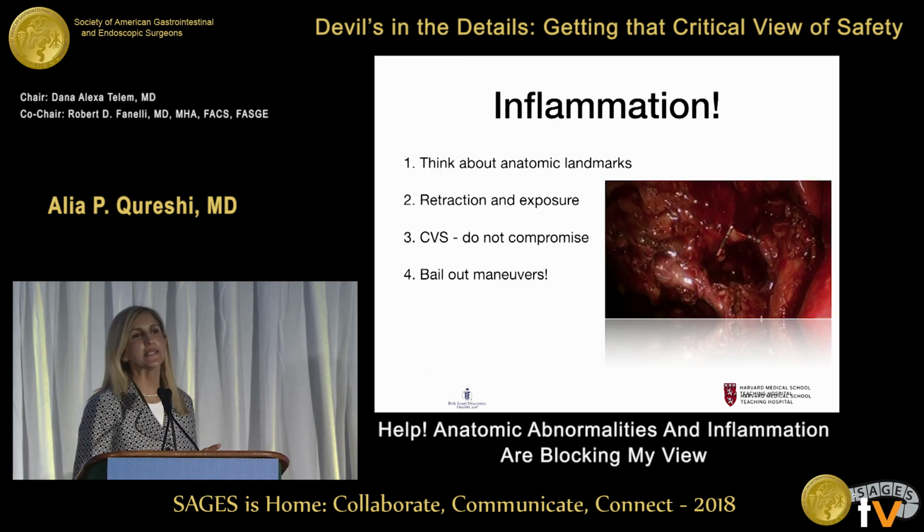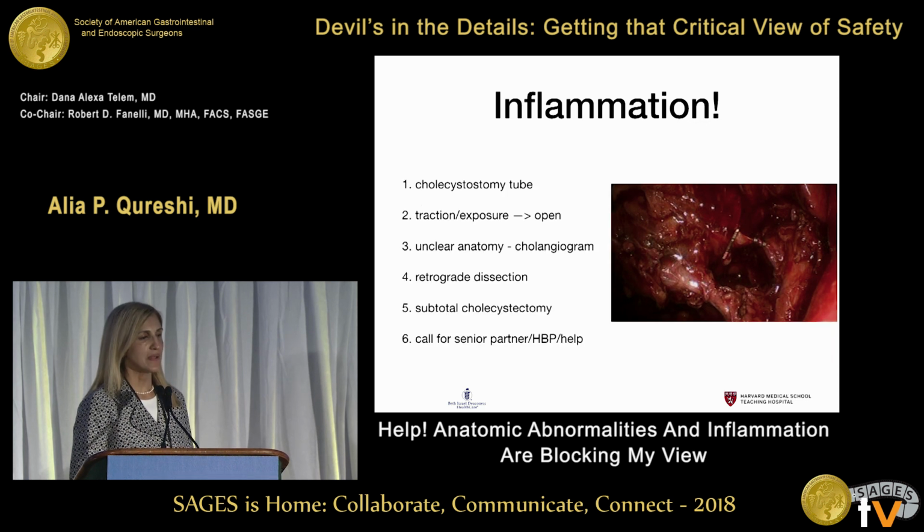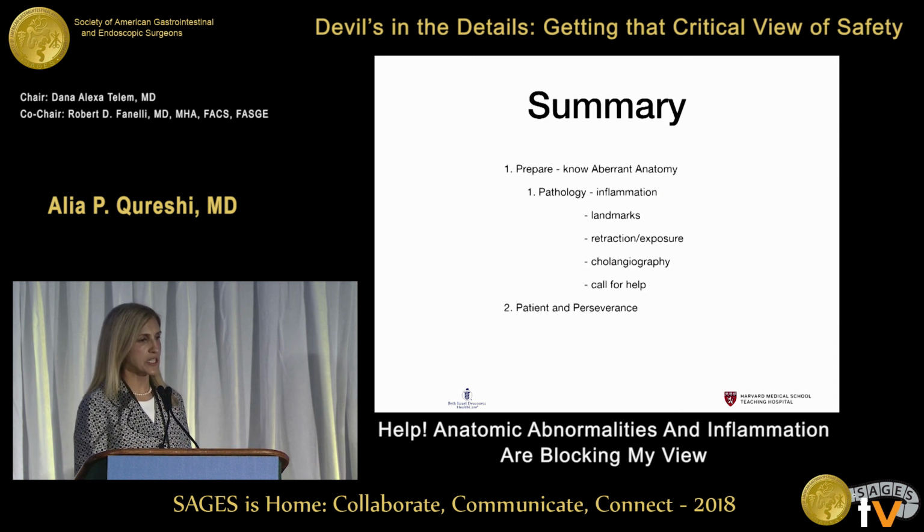But the take-home points here are the same that I've given all this lecture, and that is think about the landmarks, do not compromise on your critical view of safety, know your bailout maneuvers, know where your partners are. And I know somebody else will be covering all of the maneuvers that you will need to know when there's significant inflammation. I would add that never be afraid. Pride should never be a part of this operation. If you need help, call for help. And these are cases that can certainly challenge all of us.